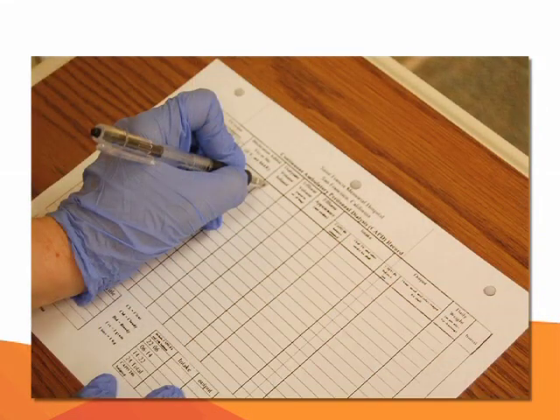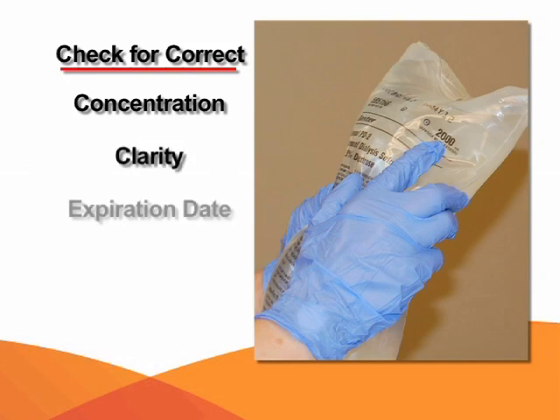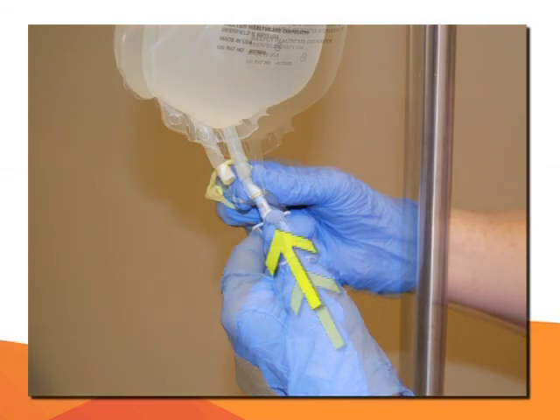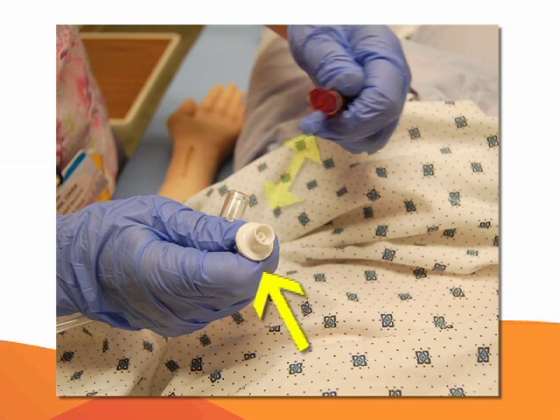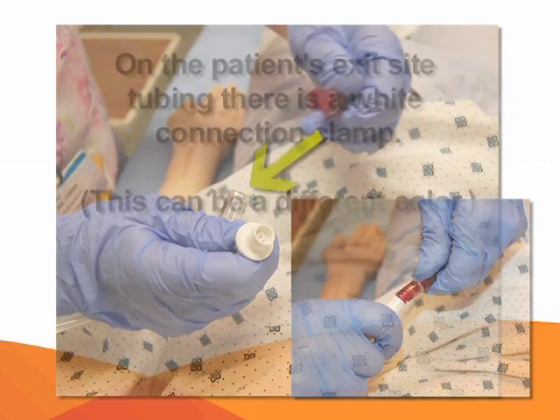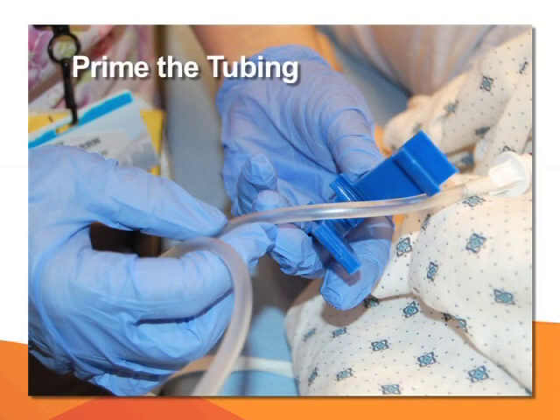Hang the dialysate bag on the IV pole and weigh it. Record the weight on the CAPD flow sheet. Again, check for the correct concentration, clarity, and expiration date. Remove the Y-set from the bag and close the blue clamp and the white clamps on the Y-set. Aseptically attach the long end of the Y-set to the dialysate bag and the short end to the patient. Remove the mini cap on the Y-set first and the mini cap on the patient's catheter. Now the tubing needs to be primed.